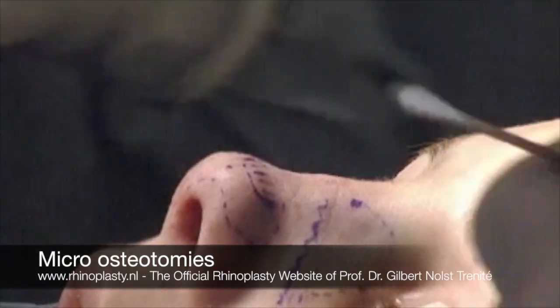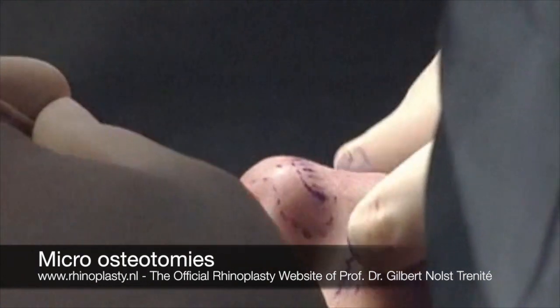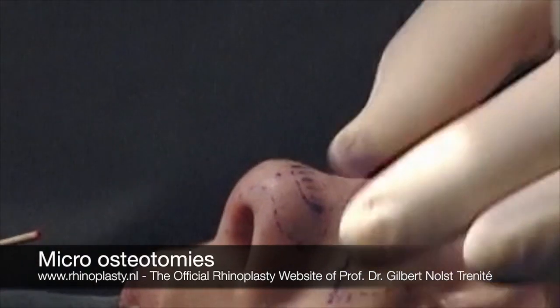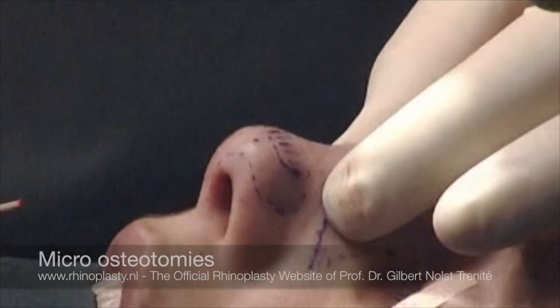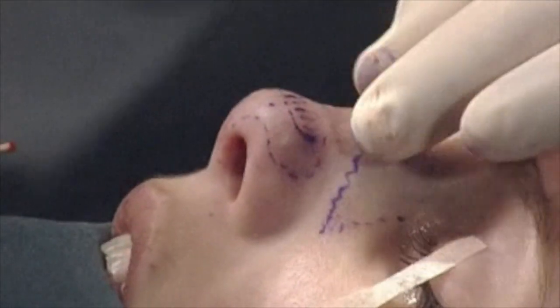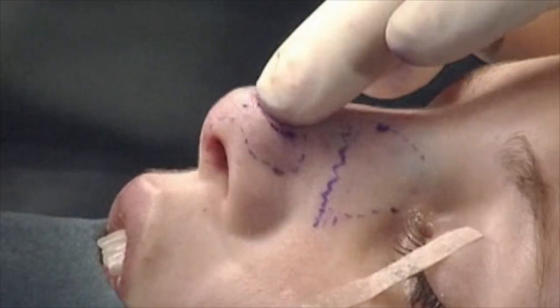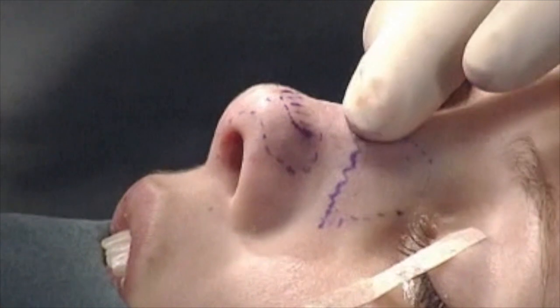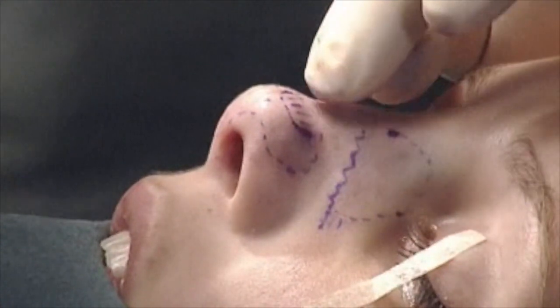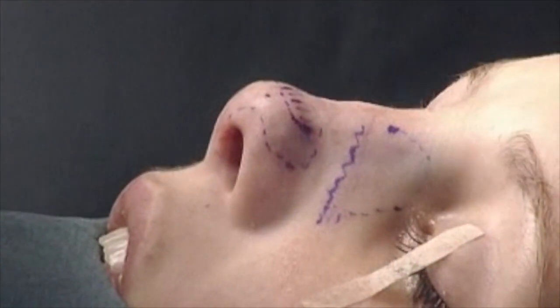Okay. So what we introduced here is an open roof. We have to close the open roof and we have to narrow and realign because there's a little deviation to the right of the bony pyramid. Therefore we have to do micro osteotomies. But before we do this, we have to be sure that there are no irregularities. So we have to check this.